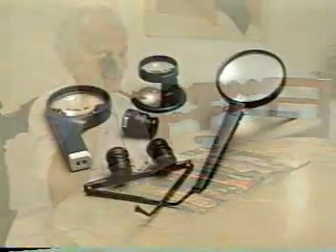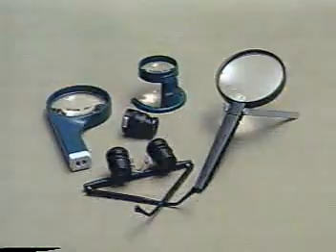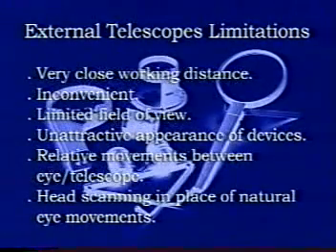The placement of a miniaturized optical device within the eyes in the dry form of AMD has several benefits when compared to external optical devices. This is now possible and is the focus of this presentation.